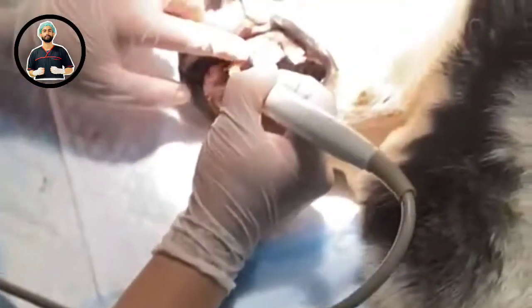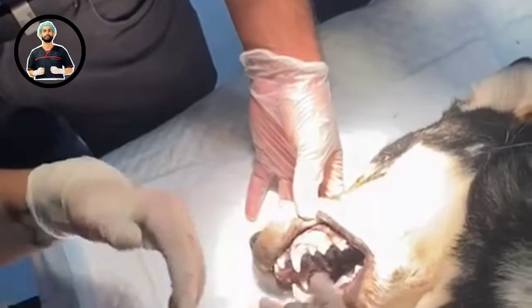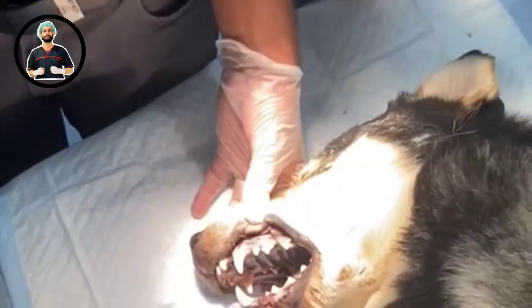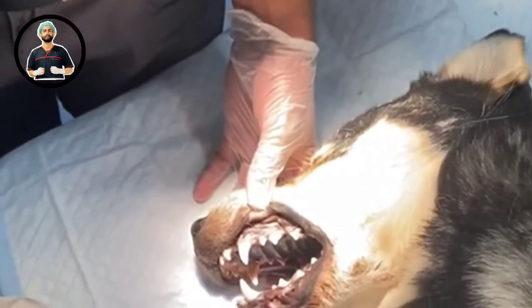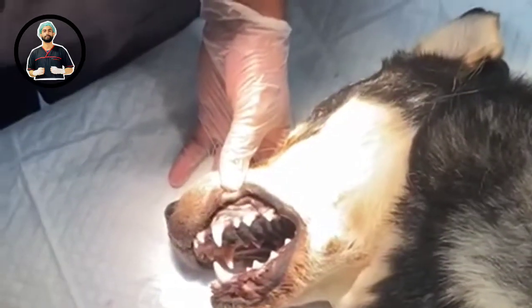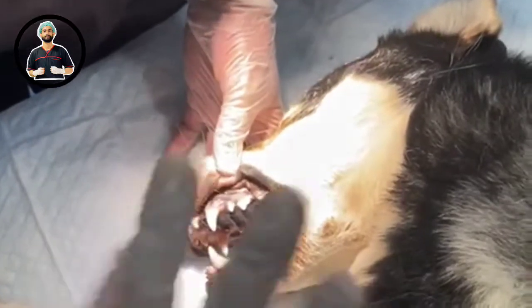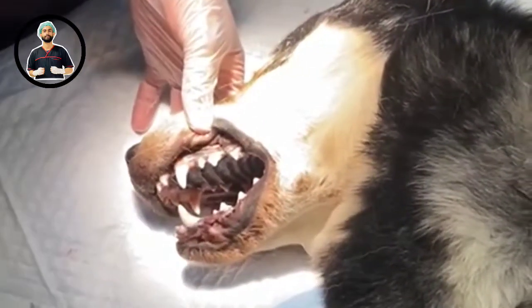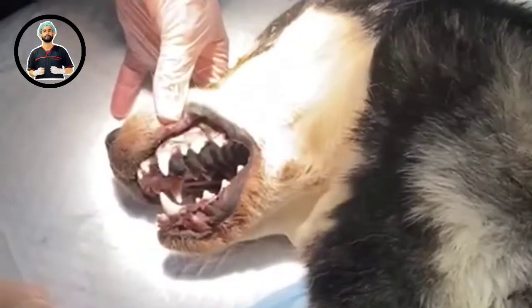Put the antibacterial solution into your machine — it has an antibacterial property, smells very minty. When you're scaling, you're getting chlorhexidine up into the gingiva which helps reduce inflammation. I think it's Eurovets that sells it — it's a little green bottle for the IM5 machine. It's actually very good for dentals, helping get rid of bacteria and reducing inflammation on the gum.